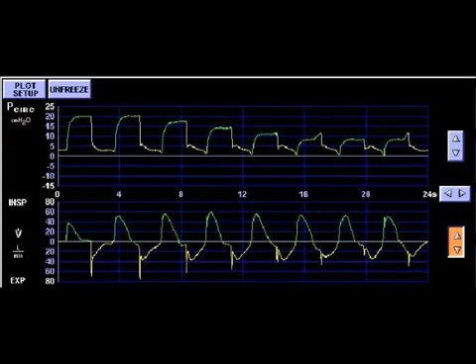You can use adaptive pressure control on a variety of patients, but I highly recommend that you do not use adaptive pressure control for patients in septic shock, with high minute ventilation demands, or burn patients. This can actually create more work of breathing. Additionally, patients that are on high levels of PEEP. So if they're an ARDS patient whose PEEP is set above 12 and they have problems with oxygenation, you're going to have issues with adaptive pressure control, also if the patient has a metabolic component going on.